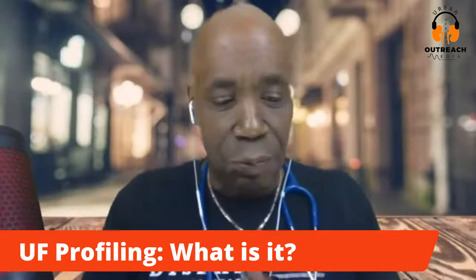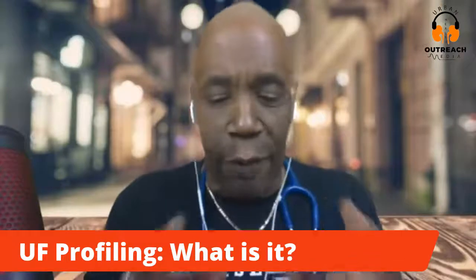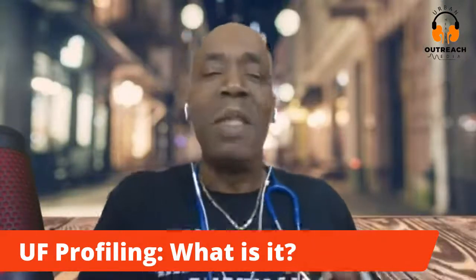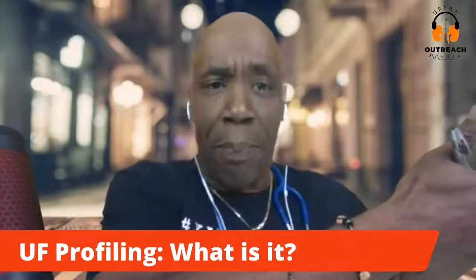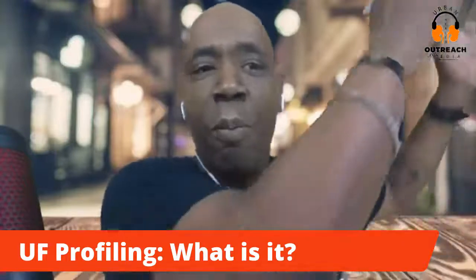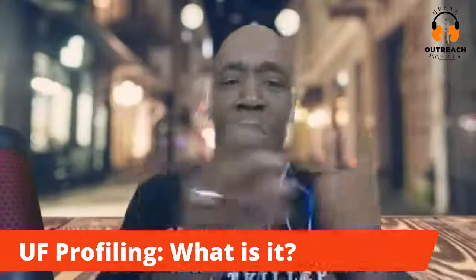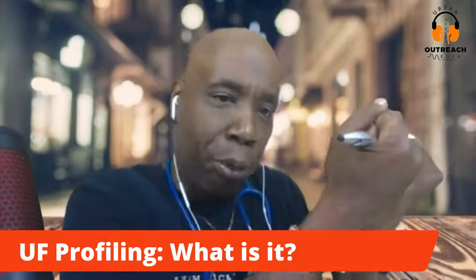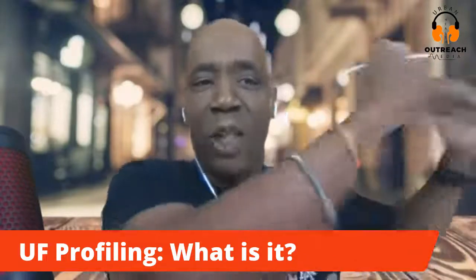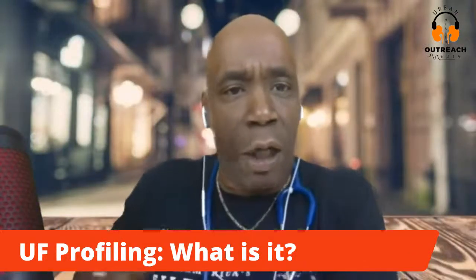Now, I'm going to give you a couple examples. A common UF profile involves programming the highest UF rate for the onset of the treatment. Say you have a patient that's taking off 5 liters, and their blood pressure is 170/90. You want to set a profile to take off the most during the beginning of the treatment, where their blood pressure is increased. And then over the treatment, the fluid is gradually taken off more slowly. In the first hour and a half or two, depending on the patient's time, that's when you take off the bulk of the fluid. And then the rest gradually comes off as the patient finishes the treatment.